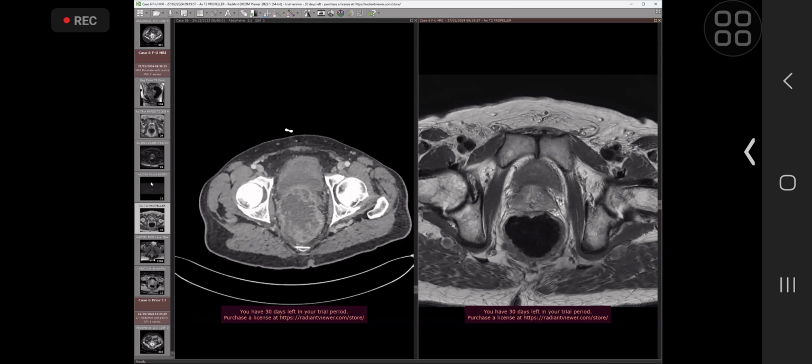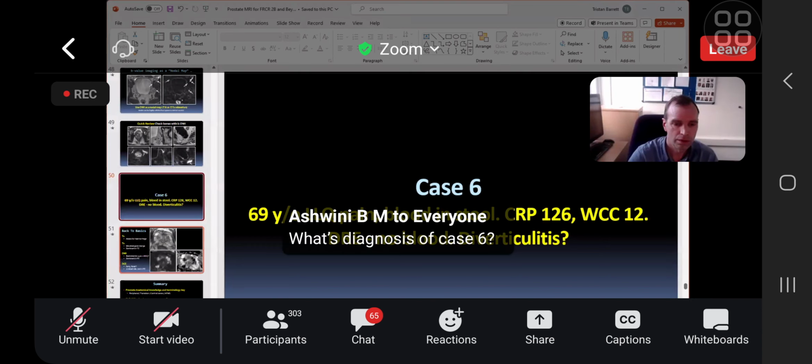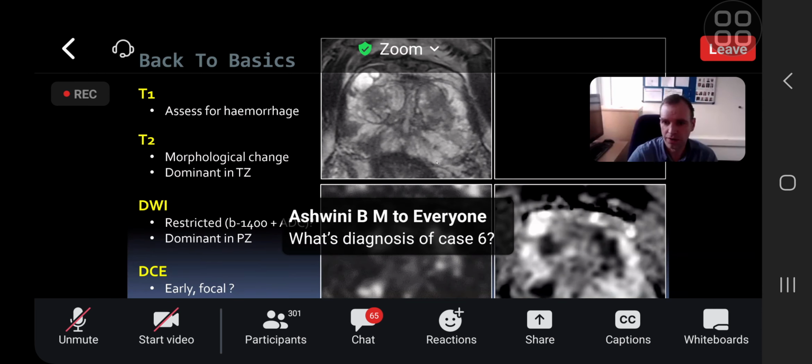Okay, let's quickly. We're kind of at the summary slide, so I'll take back control. We'll stop sharing this, and we'll go back to the summary slides. So let's go back to our very first case.